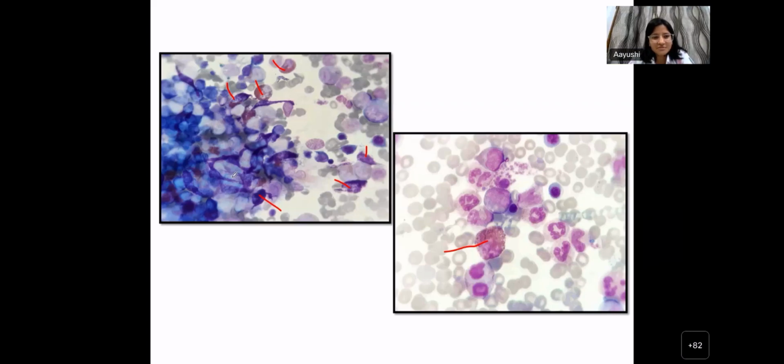Maybe, sir, mastocytosis. Okay, mast cells are increased, so you'd like to check whether those mast cells are abnormal or not. But let's say for one moment that mast cells are also not there. Then this is a hypercellular, myeloid preponderant marrow with some eosinophilia. This kind of picture you typically see in what kind of neoplasm? Somebody says AML M4. Why do you say AML M4? I can't see increased blasts in this, so why AML?